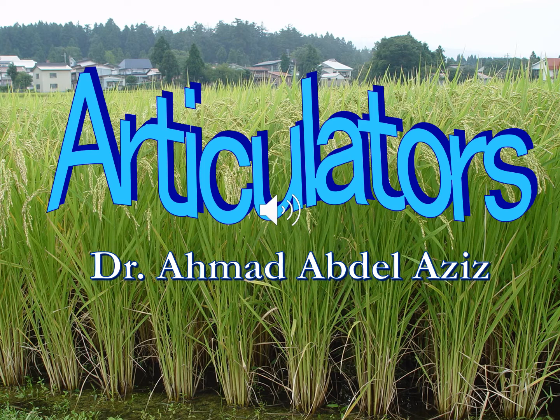Today we are going to talk about the articulators, which is a very important tool used in any prosthetic work, whether it's a complete denture or a single crown that is done indirectly in the laboratory.